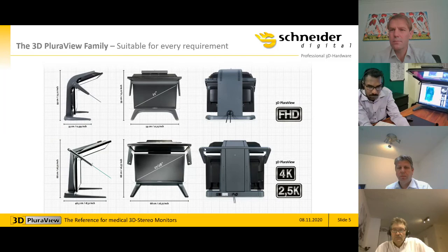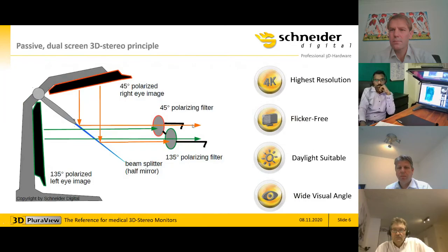This is just a side view, front view, and back view of the monitors with some sizes. This is how they would look on your desktop. The smaller ones are 33 centimeters deep. This is the foot, and the other ones are about 50 centimeters deep. So they are still a good size for most desks, I would say.